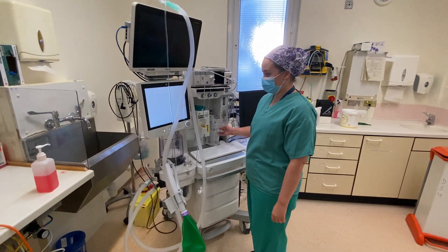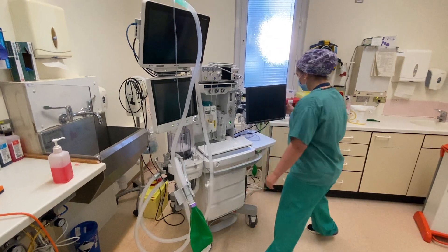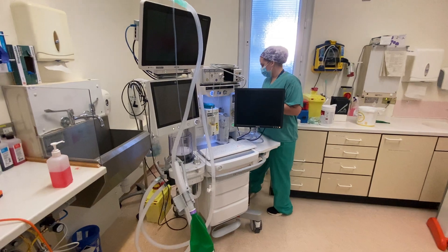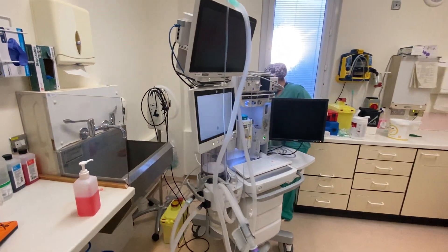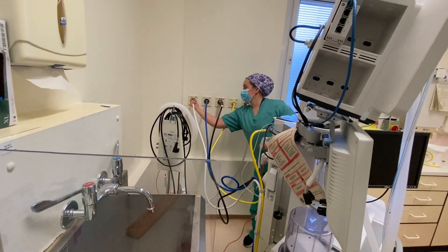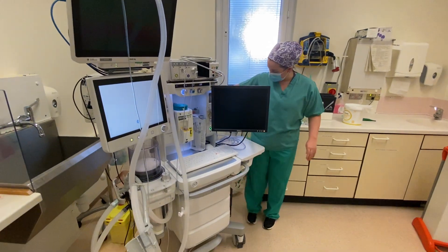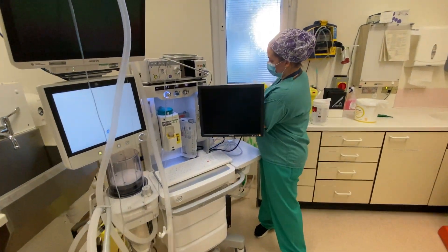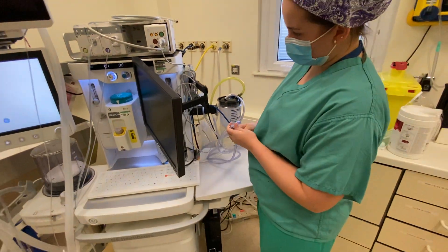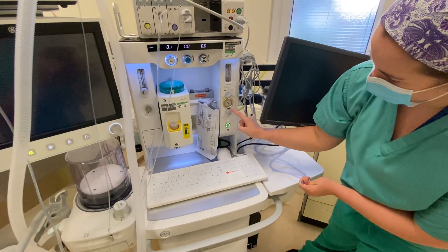First thing in the morning when I come in and check my anaesthetic machine, I turn it on and then check the emergency features first, which includes the tug test of the pipelines, making sure they're all in and safe. And while I'm waiting for the machine to turn on, I check my suction as well by occluding and then checking that it's actually suctioning.